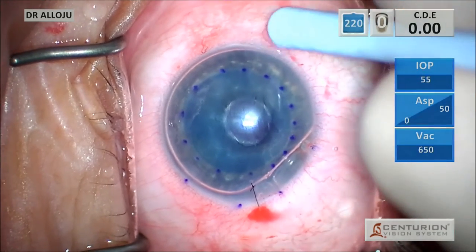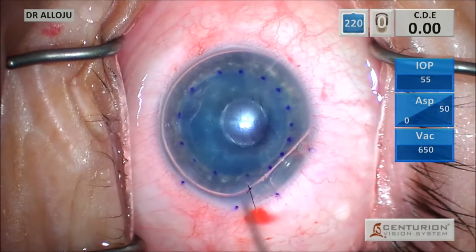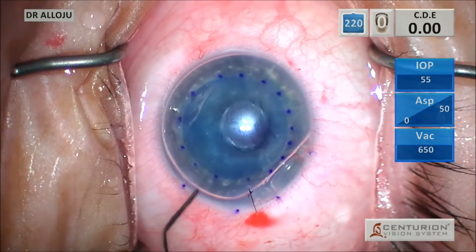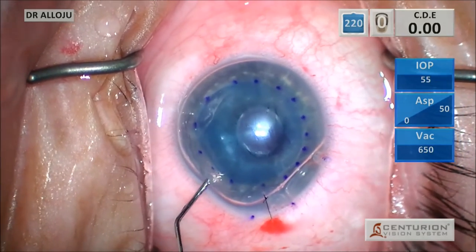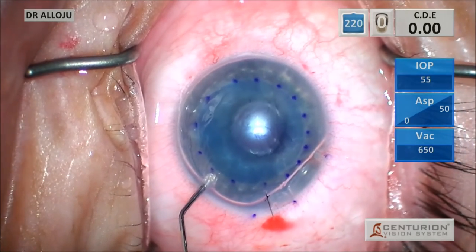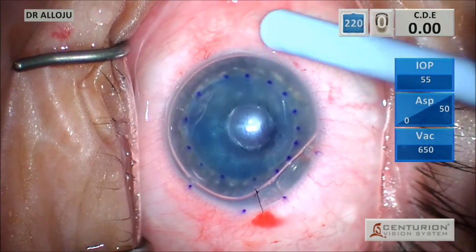Once the full air fill is completed, we end up evacuating some of the air to leave about a 9, maybe 10 millimeter bubble at the end of the case, aiming for about a mid-20s IOP.